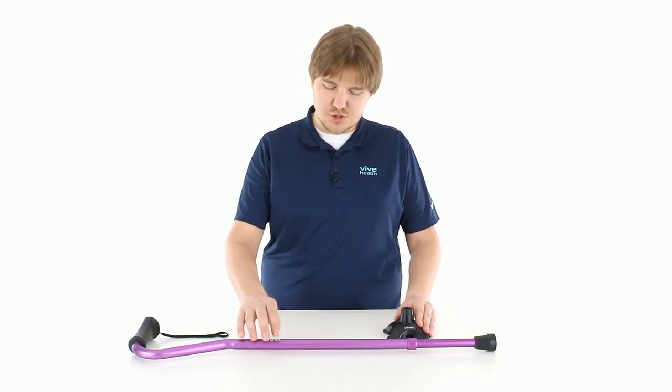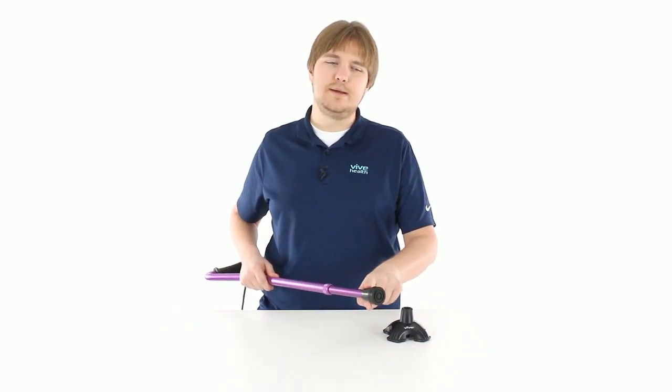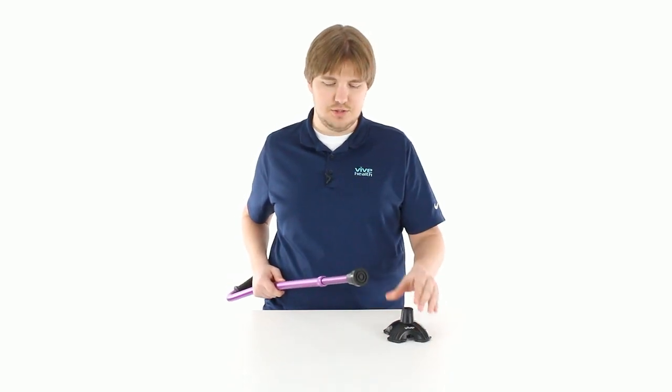The Quad Cane Base will fit onto any of our canes that have a single tip. So like our pre-built quad cane, this won't attach to.